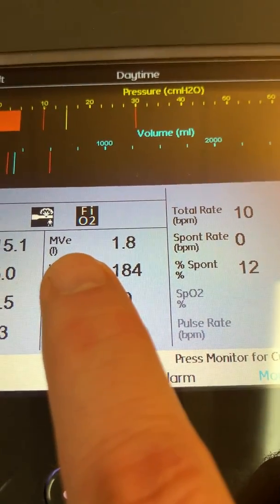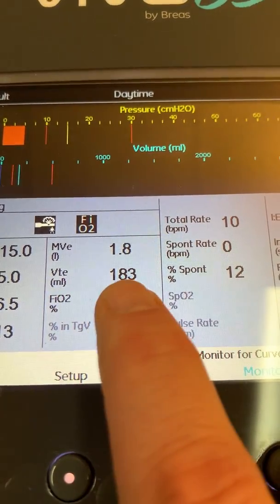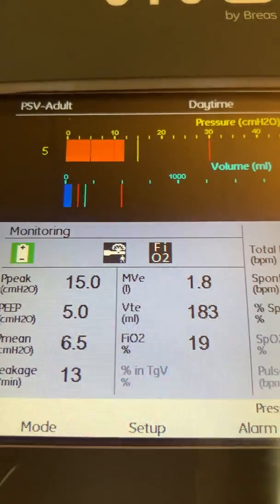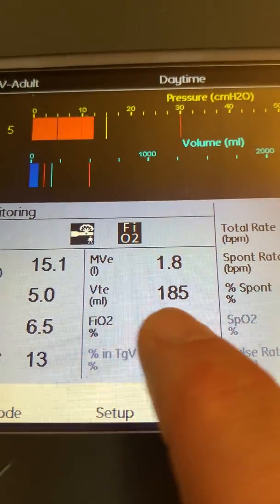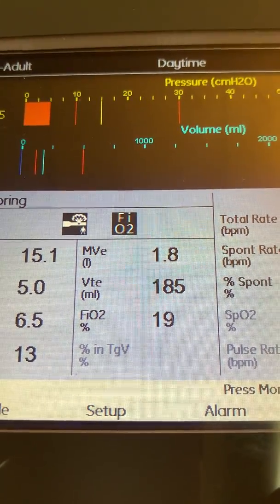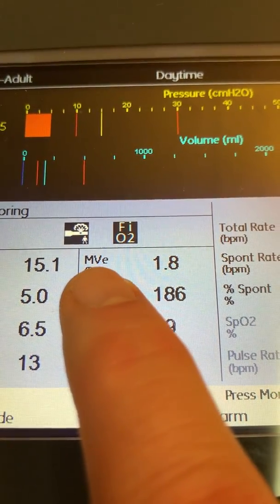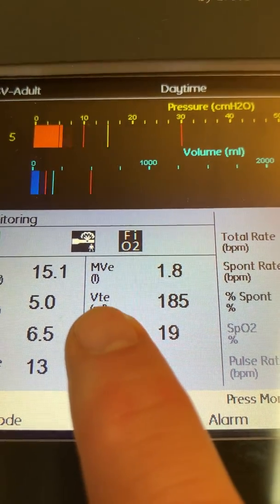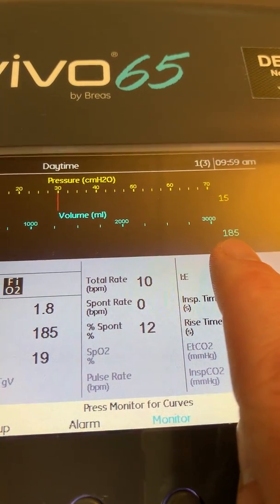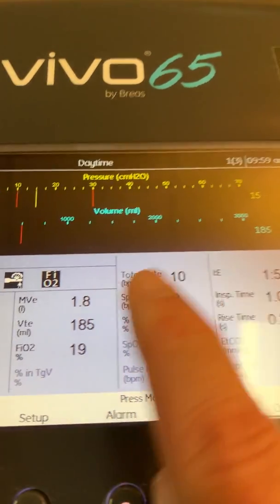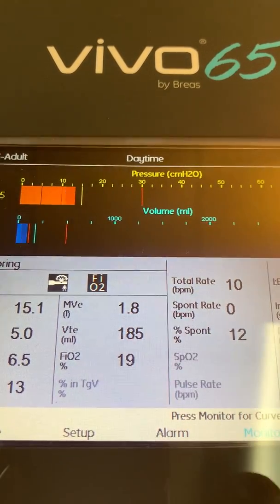In row two: minute ventilation and exhaled minute ventilation in liters, and exhaled tidal volume in milliliters. When using a passive circuit, these values display expiratory calculated measurements. With a single limb active circuit, this would display inspiratory minute ventilation and inspiratory tidal volume. With a dual limb circuit, you get inspiratory tidal volume, exhaled tidal volume, and exhaled minute ventilation.